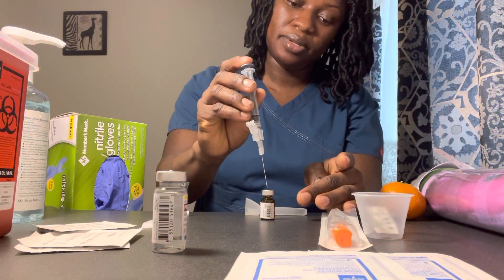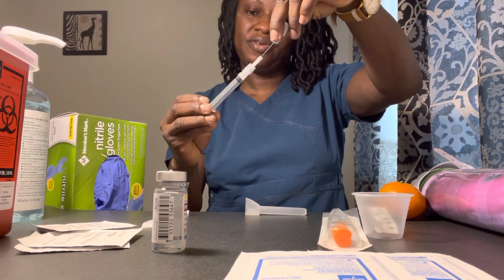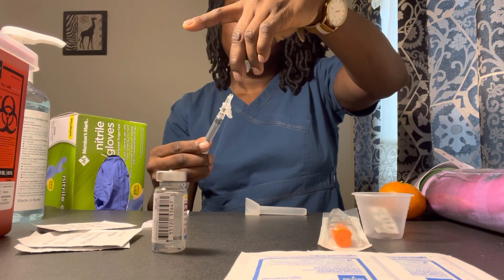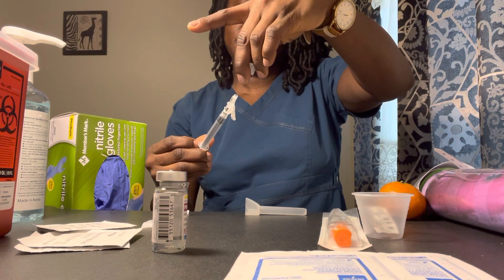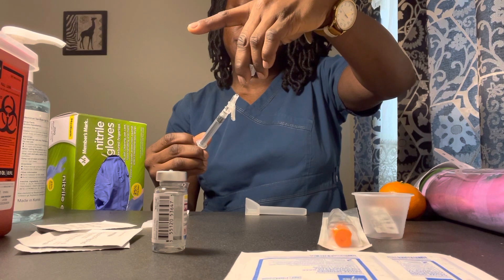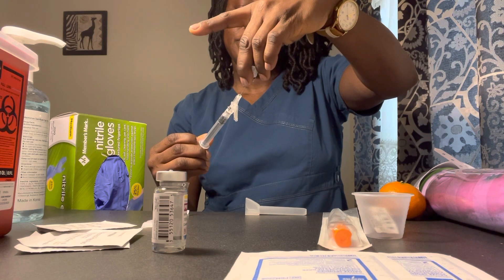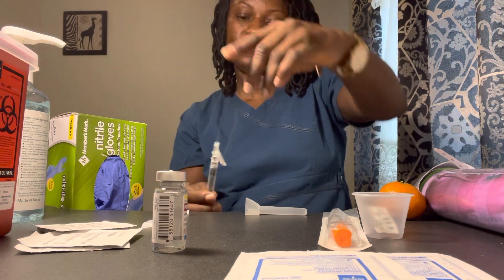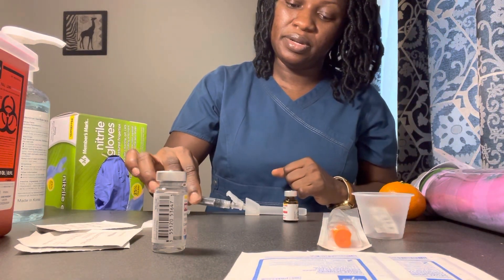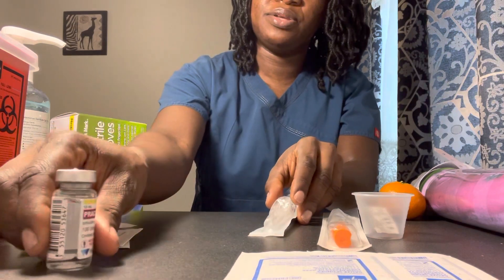Drawing my 0.4 ml — making sure there are no air bubbles. I have 0.1, 0.2, 0.3, and 0.4. I have 0.4 ml and there are no air bubbles. Go ahead and scoop the cap back on the pack. These vials are going back into the refrigerator.